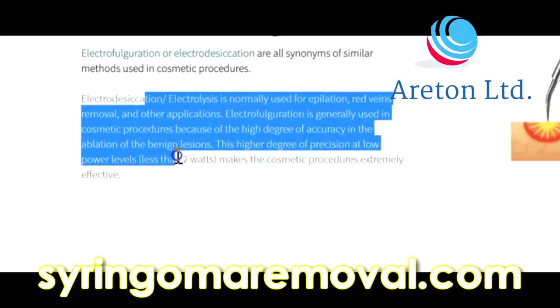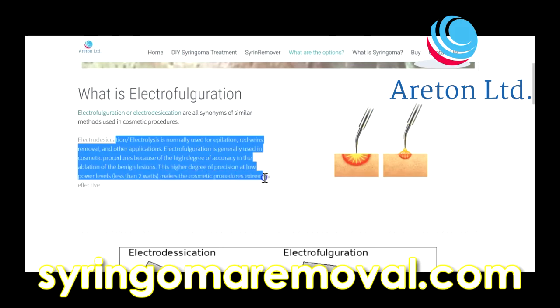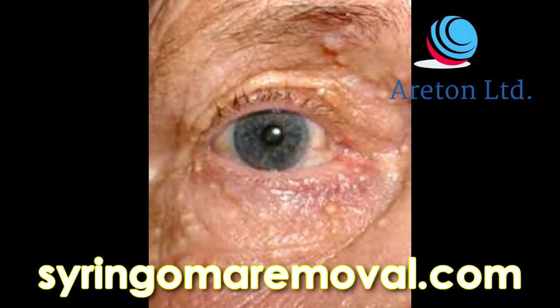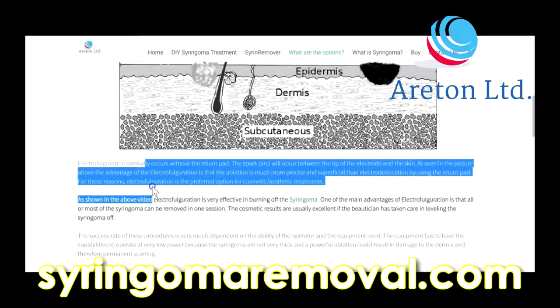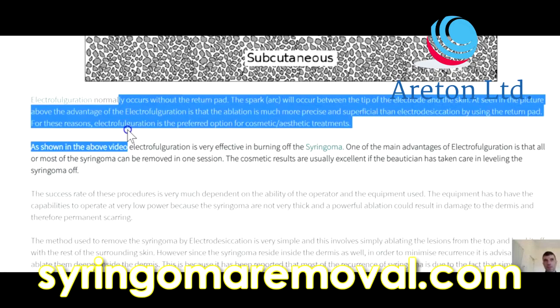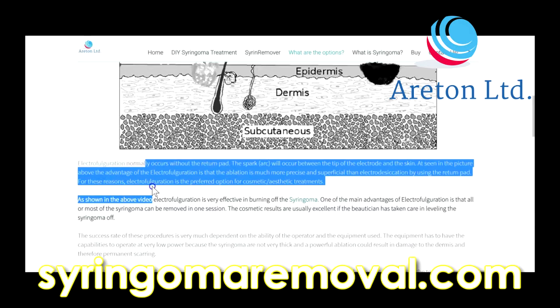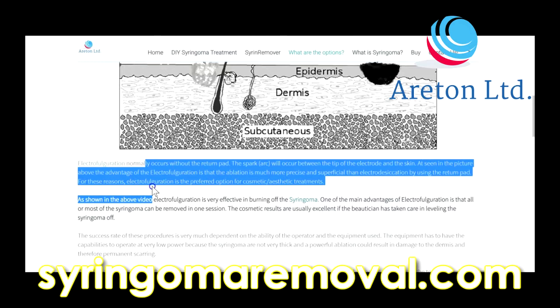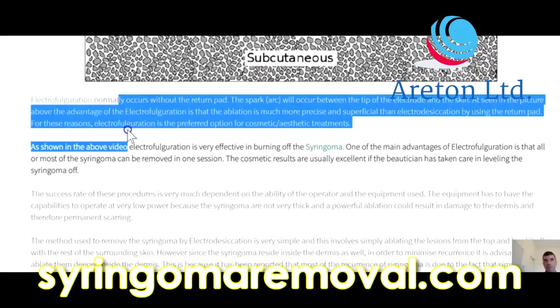The higher degree of precision at low power levels — less than 5 watts — makes this cosmetic procedure extremely effective. Electrofulguration normally occurs without the return pad; the spark arc occurs between the tip of the electrode and the skin. As seen in the picture above, the ablation is much more precise and superficial than electrodesiccation using the return pad. For this reason, electrofulguration is the preferred option for cosmetic aesthetic treatments.